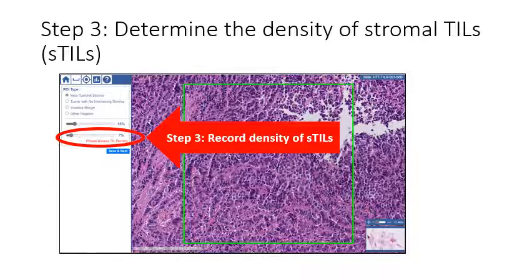Then, assess the density of stromal TILs within the ROI. You are free to pan and zoom to other areas of the slide to see the tissue context and to help you annotate, but please only evaluate the ROI marked by the green box. You may also want to refer to the calibration cheat sheet and other training materials to help you as you annotate.